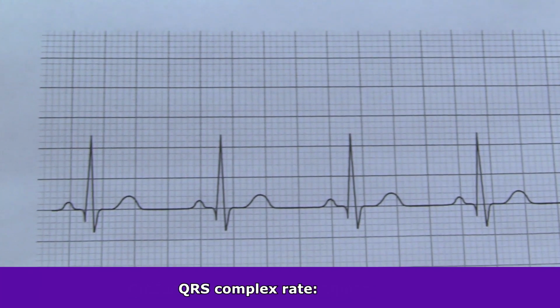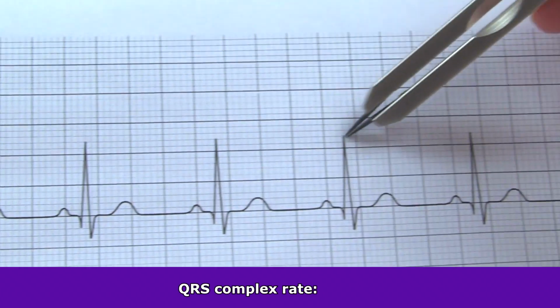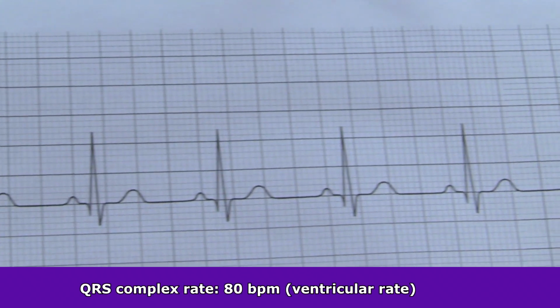Next, let's count the rate. So count each QRS complex and then multiply by 10. So we have 1, 2, 3, 4, 5, 6, 7, 8. So 8 times 10 is 80. So we have a ventricular rate of 80, just like the atrial rate.